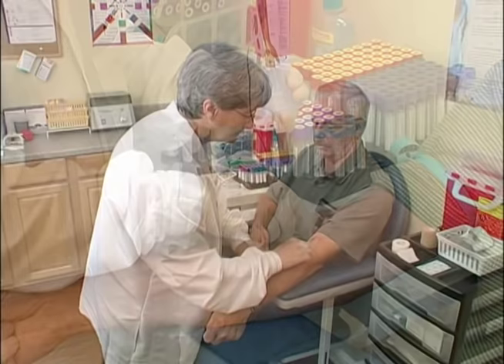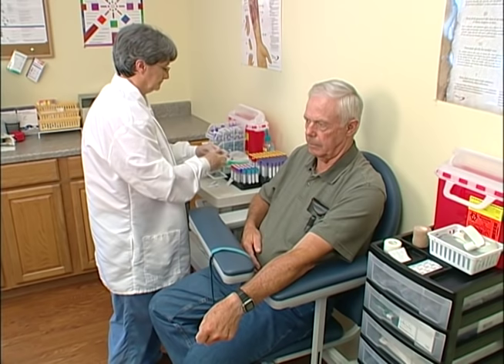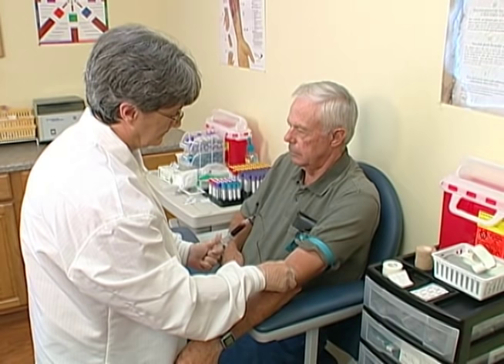If using a syringe with a winged collection set, select and cleanse the site as usual. Assemble the device, break the seal of the plunger, and expel the air from the syringe by advancing it fully forward. Perform the puncture and withdraw the plunger until the appropriate volume of blood has been obtained.